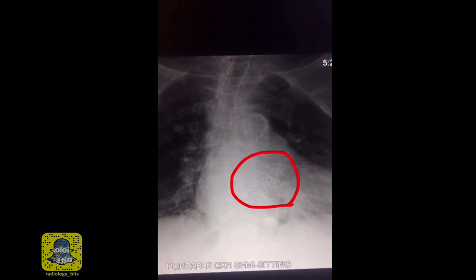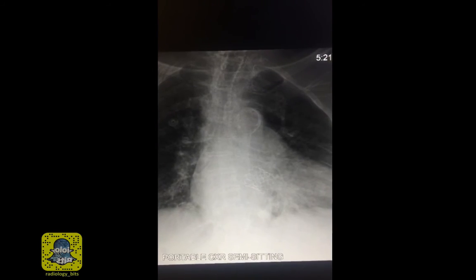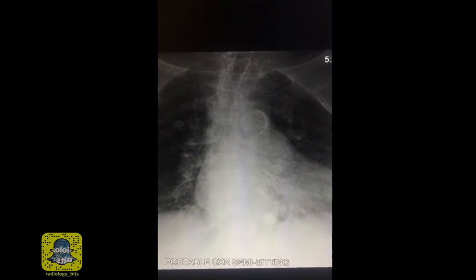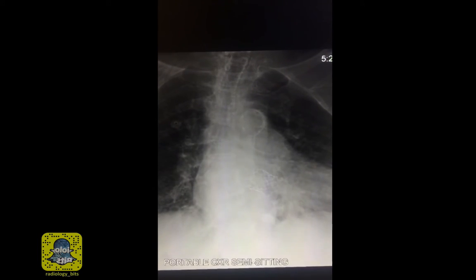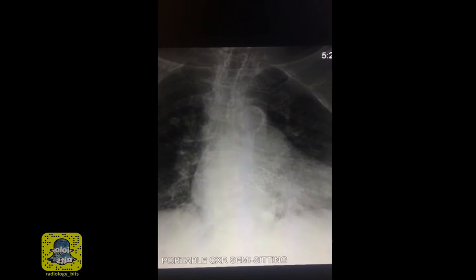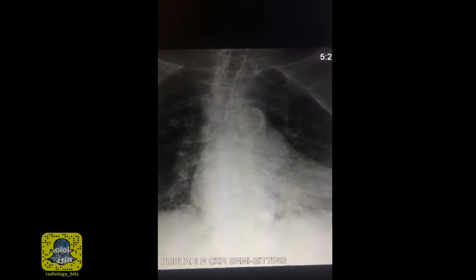What I didn't show in this case is the value of utilizing cardiac CT in assessing the pre-TAVI patient. This is a relatively interesting and huge topic that has multiple points that we could emphasize when we show that later. So keep tuned to a next clip, hopefully in the near future, where we discuss that topic.